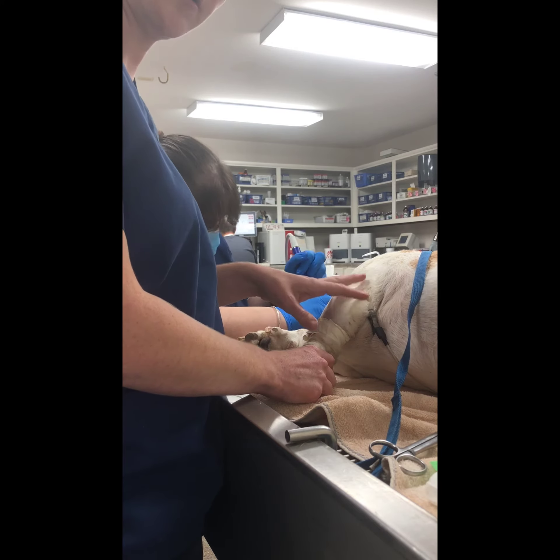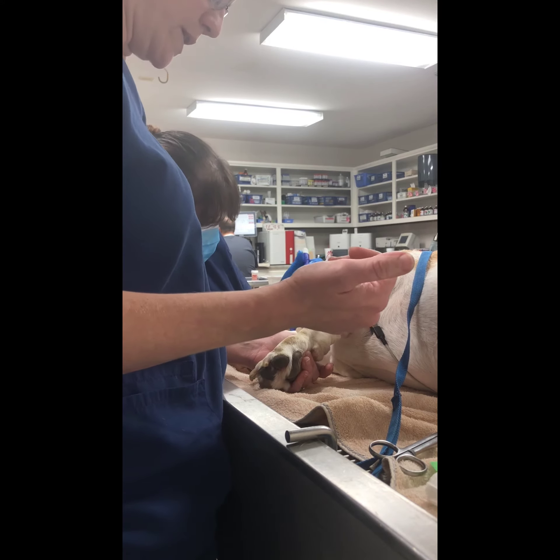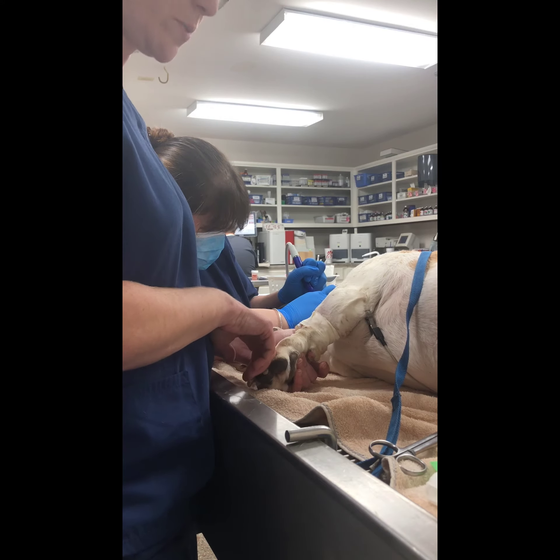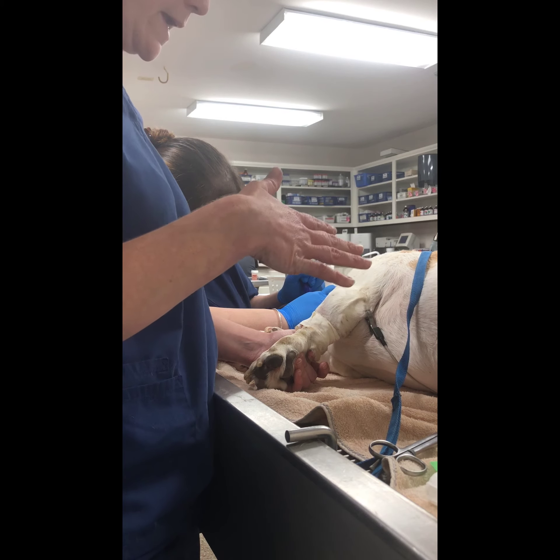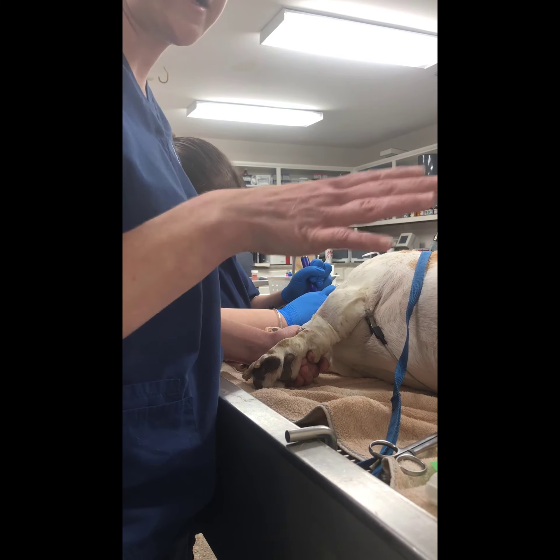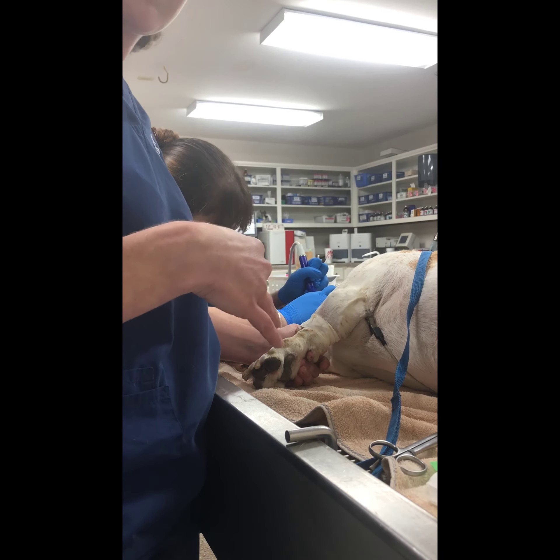We placed another catheter, but I'm going to go ahead and remove this other one. We always flush the catheters every four hours to be sure that they don't occlude, and also whenever they are on fluids, we want to make sure that we change the entire IV administration set at least every four days.